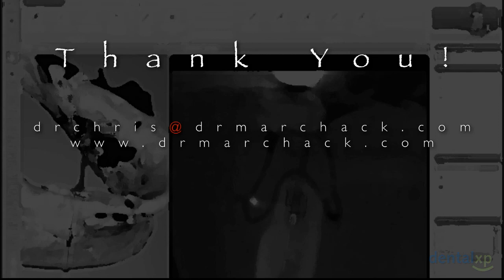And with that, I thank you for spending the time with me and looking at what we need to have in regards to implant placement with a surgical template and the three-dimensional imaging that has been acquired through cone beam CTs. Thank you.